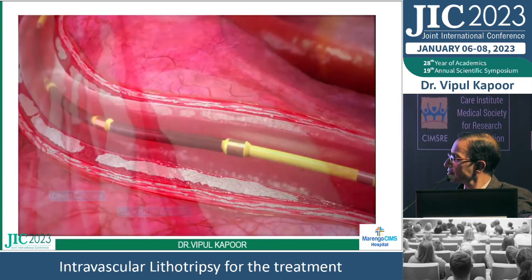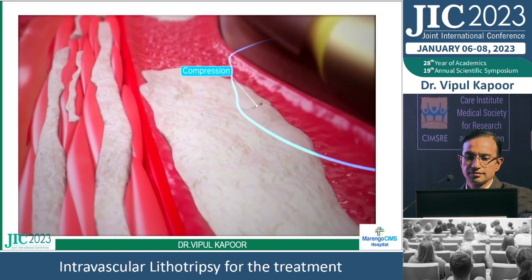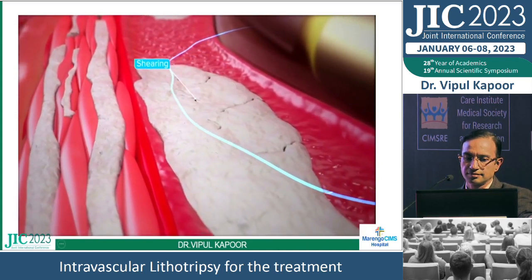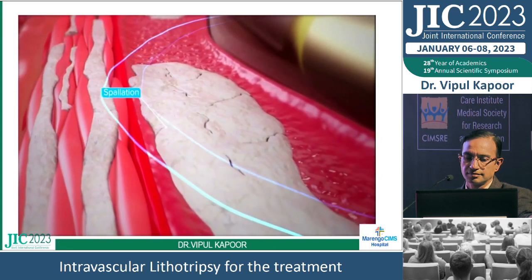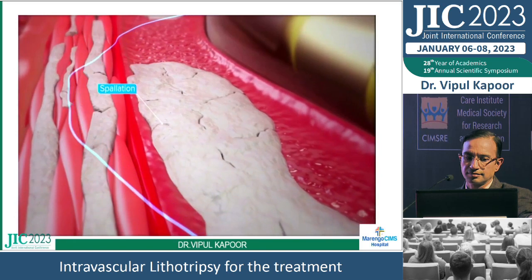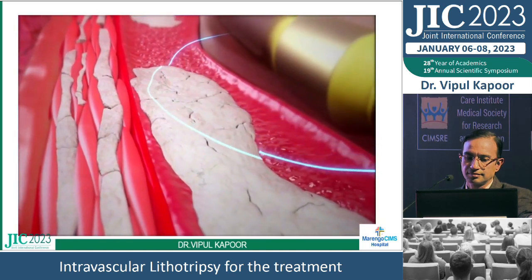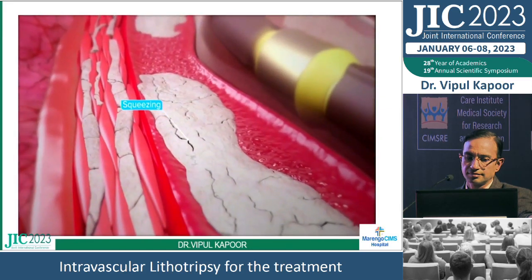The leading edge of the shock wave imparts compressive stress as it encounters calcium. Shearing occurs as it passes through the calcium. At the rear edge of the calcium, the shock wave is both transmitted and reflected, inducing tensile stress that pulls the calcium apart. Squeezing occurs when the shock waves entering the calcium travel faster than the remaining wave propagating outside the calcium.